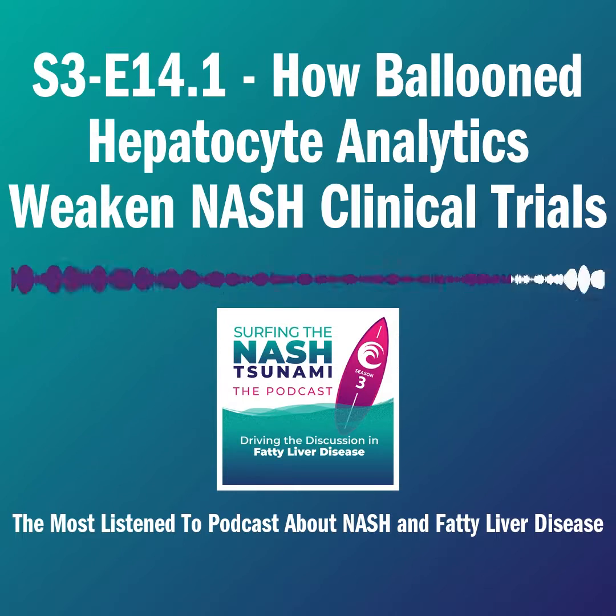And I think that opens the way, because what we can now do is begin to train these algorithms, as we've demonstrated with Q ballooning 2, and use that, I would hope. And there's a caveat here, which is that the regulators clearly need to agree to this, but we need to use these techniques to allow us to standardize our assessment of ballooning and use that then to be more quantitative. It doesn't necessarily matter if Q ballooning 2 is perfect any more than it doesn't really matter if a given trial pathologist is perfect. What we require, though, is something that is quantitative and consistent. And once it is able to do that, we can then detect change.